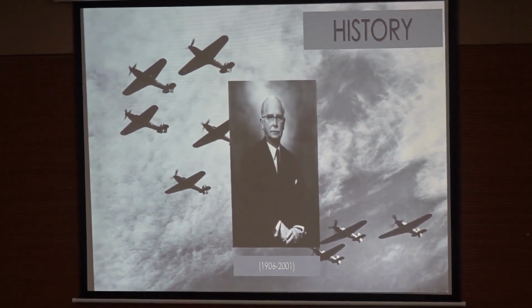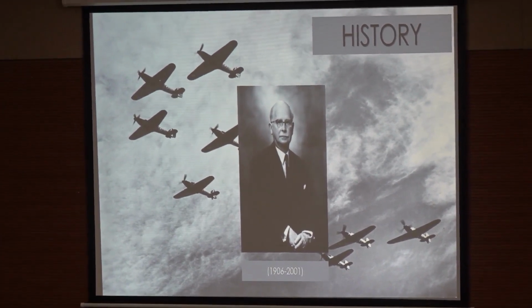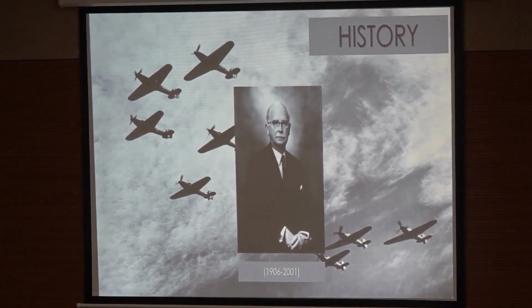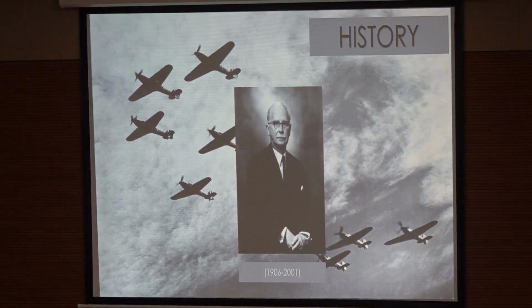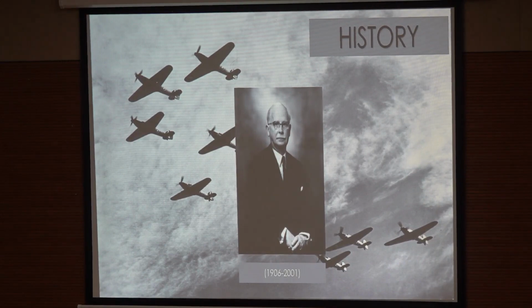He had this discovery that the pilots who were flying and were coming to him with an eye injury usually had an inert material in the eye, which was from the canopy of the fighter plane. It was made up of PMMA, and that PMMA was inert and usually stayed in the eye for a longer period.